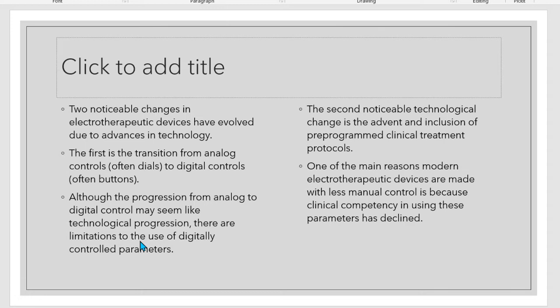However, why is this happening? Why is there a change from analog to digital controls? One of the main reasons is a decrease of clinical competency in using manual controls.